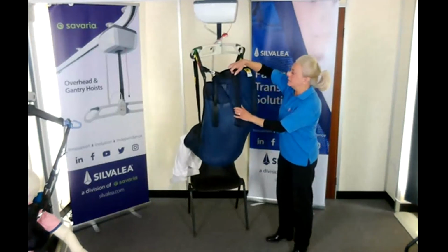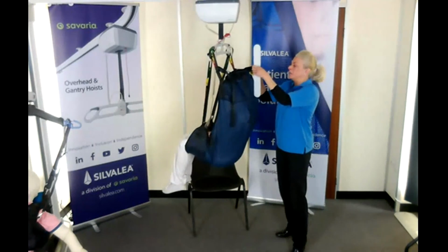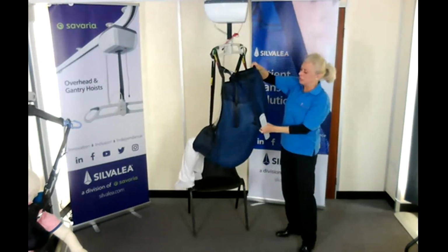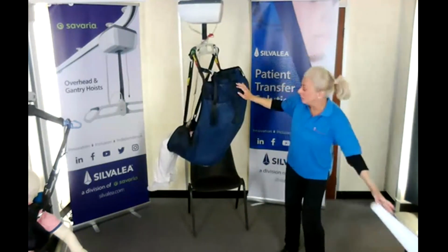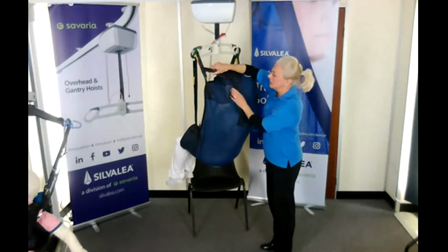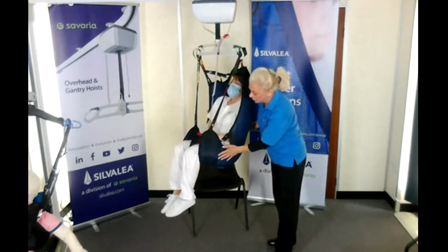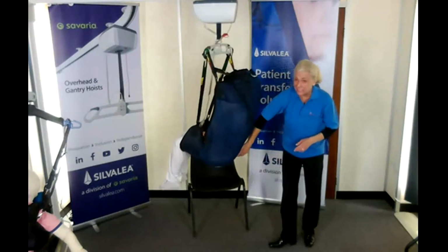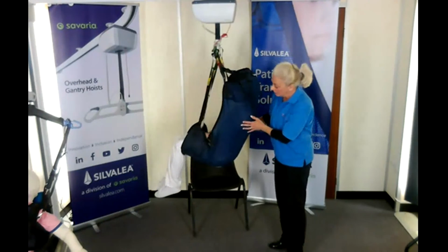The bones in the back section here, they can be removed. Often they are removed because people prefer not to have them. They could be too restricting if you can put your head back. So it's fine if they're taken out because we've got head support tapes here that can be adjusted to give the right positioning for the head support there. Good support to the femurs there. There is a little bit of access for toileting if needed. So if it is required, then we can transfer to the toilet.